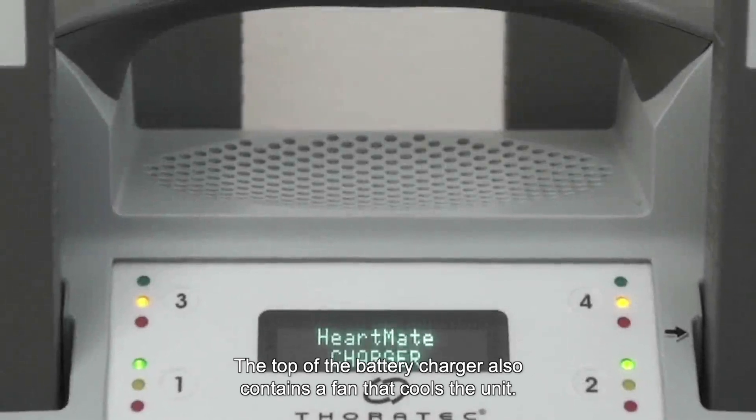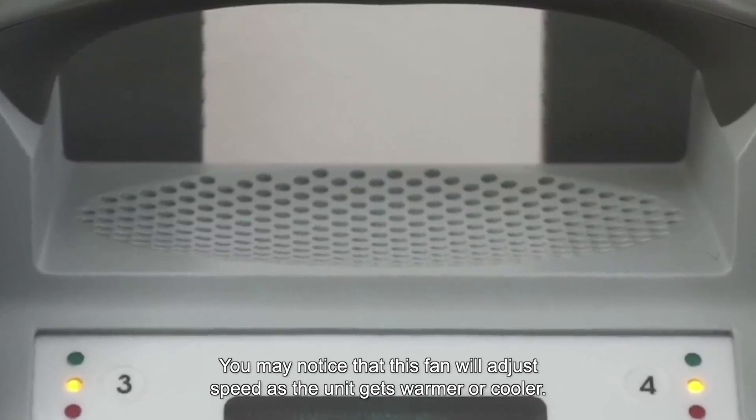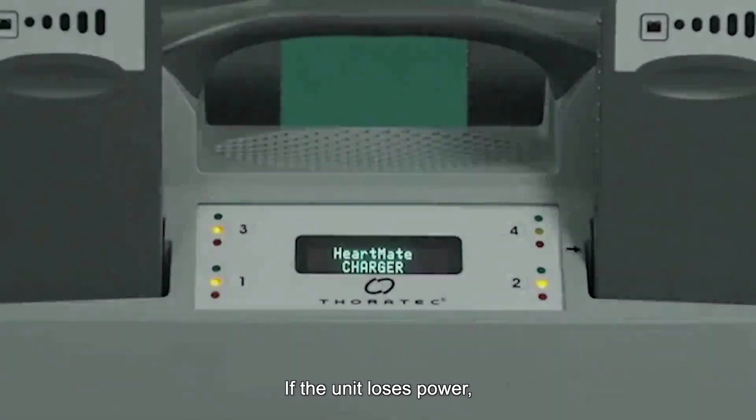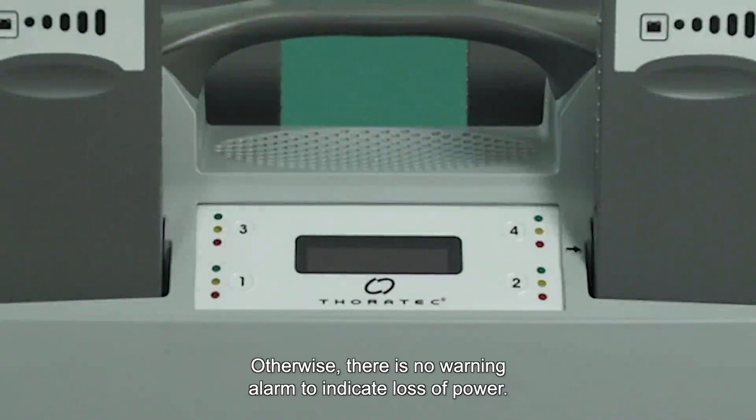The top of the battery charger also contains a fan that cools the unit. You may notice that this fan will adjust speed as the unit gets warmer or cooler. If the unit loses power, the display screen goes blank and the pocket lights turn off. Otherwise, there is no warning alarm to indicate loss of power.